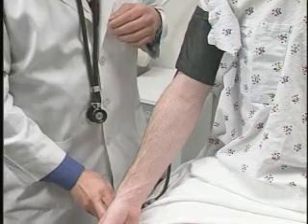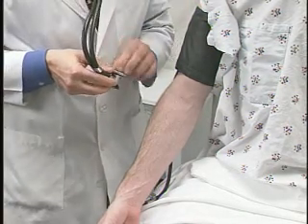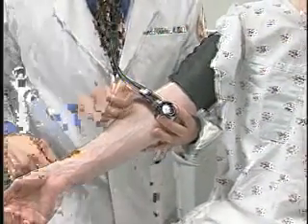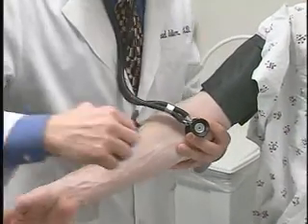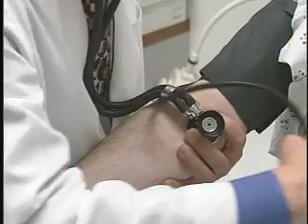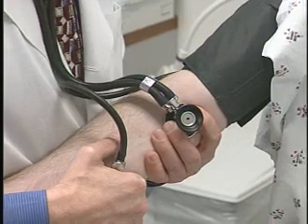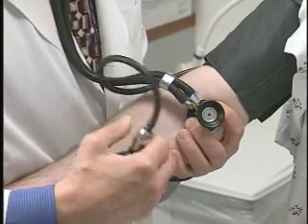So when I go to auscultate the blood pressure, I know I only need to auscultate above about 20 millimeters of mercury over approximately 110. I don't need to blow the cuff all the way up to 200 and hurt his arm. You notice that the brachial artery should be about at the level of the heart, but the patient's arm should also be relaxed, so you as the doctor should be the one holding the arm up. Don't ask the patient to hold their arm up, because that again can falsely elevate their blood pressure.